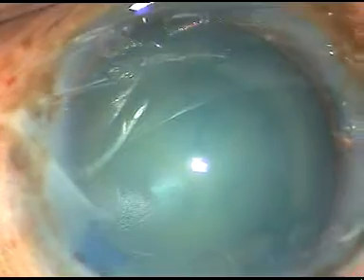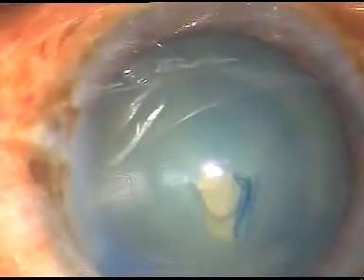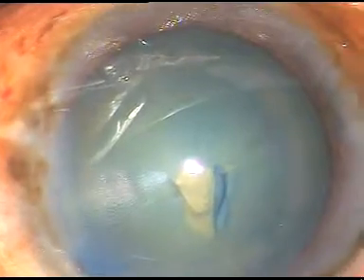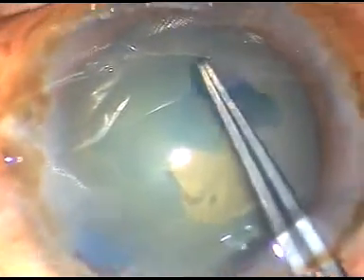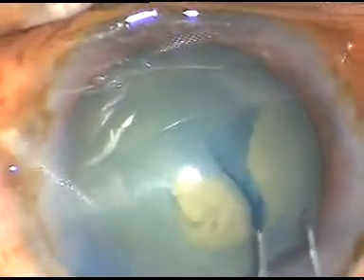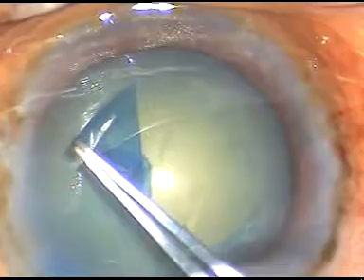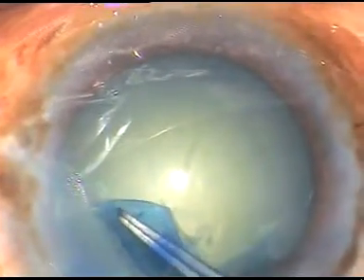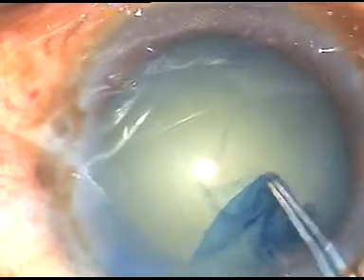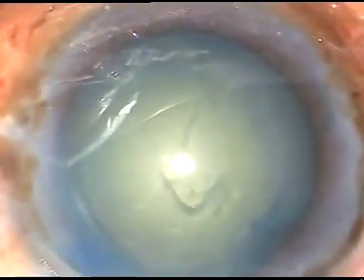Now I am incising the capsule with a 26-gauge bent cystitome, holding this flap with utrata forceps, going anti-clockwise and performing this continuous curvilinear capsulorrhexis. I tend to the anterior leaf of the main incision so that leakage of viscoelastic substance becomes minimal.